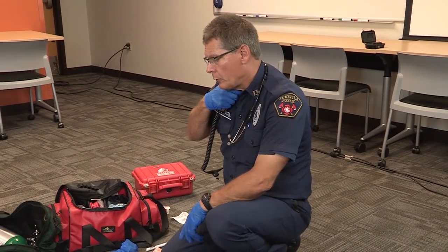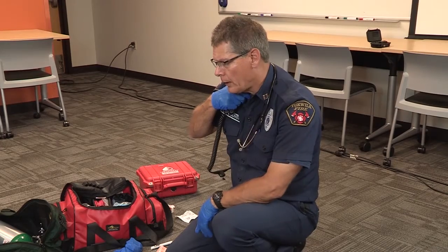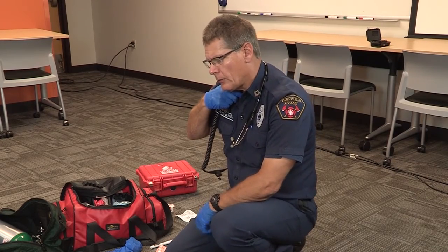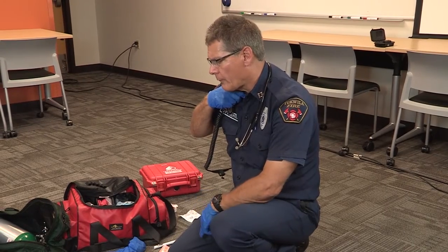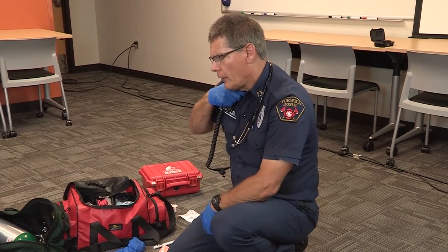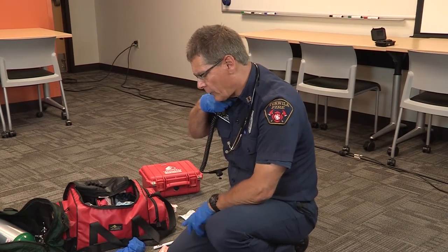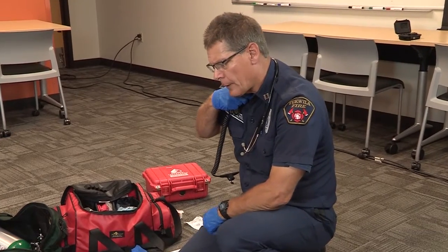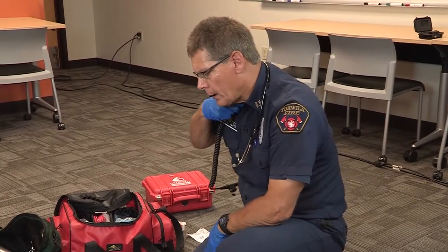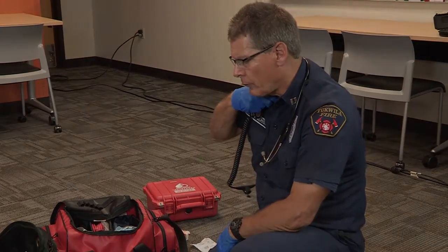Update the incoming medic unit with a short radio report: 32-year-old male reportedly overdosed on pain medications. We're assisting with bag valve mask. We administered one milligram of Narcan via nasal. Currently we have a blood pressure of 104 over 94 with a rate of 80. Pulse ox went from 92 to 96 percent. Lung sounds are clear, equal, bilateral both before and after administration of Narcan.